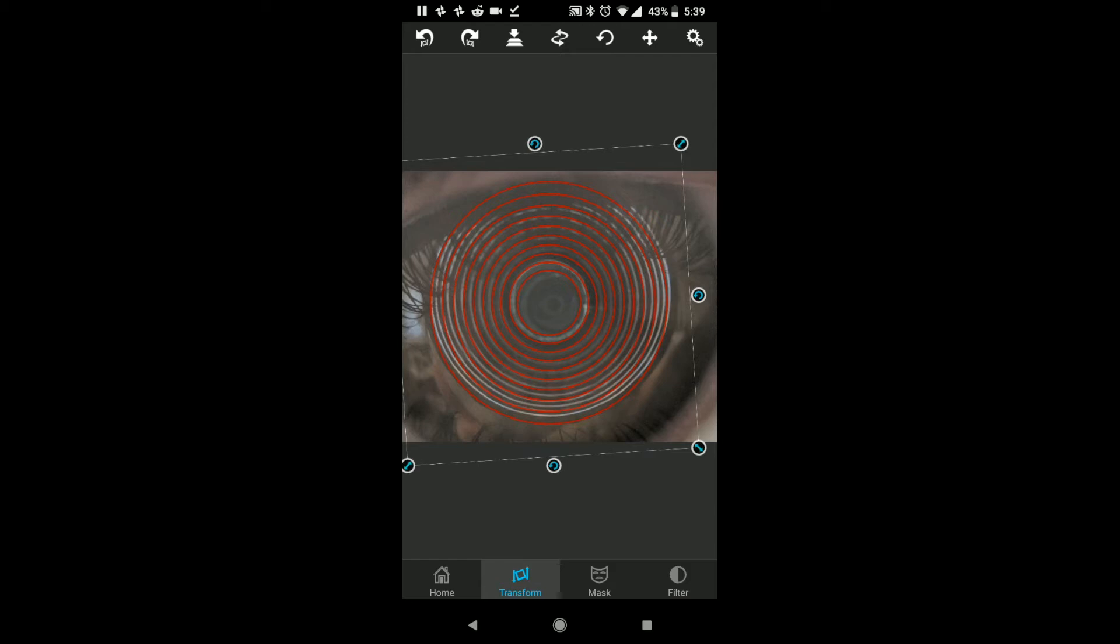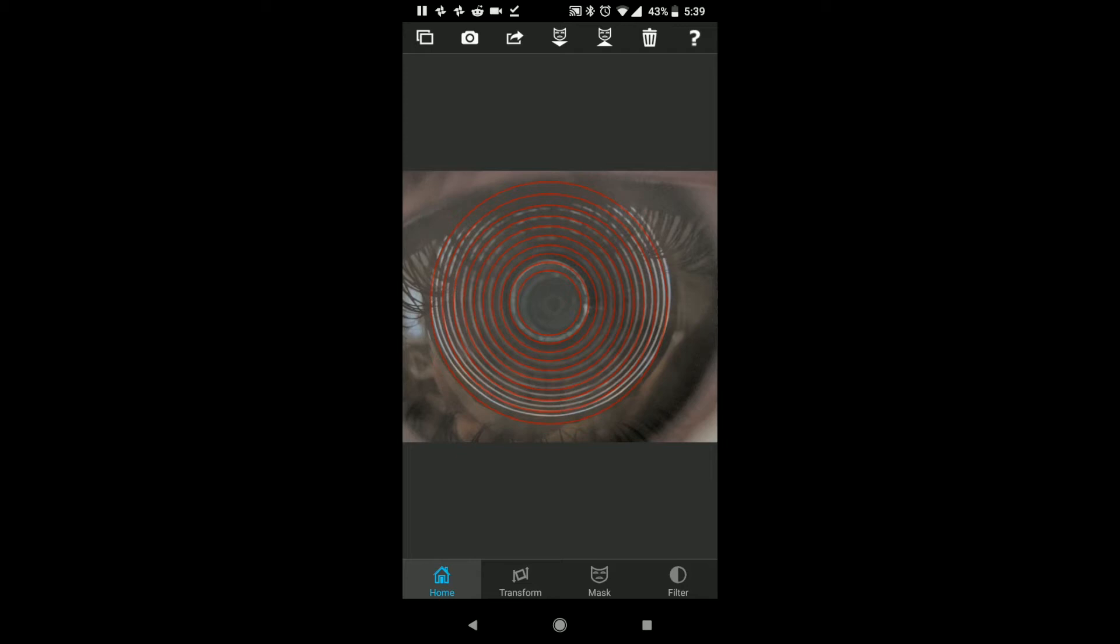I am going to say to save it, to merge the layers, which is on the top bar, the third one over, the arrow pointing down to the two sheets, which is this one. Do you want to merge them? Yes, I do want to merge them. And now we're just going to save this to our pictures.